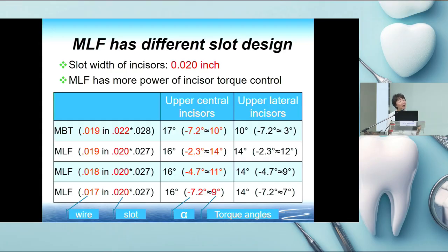That way we can retract the anterior teeth better, with better anterior torque control and less friction, so we get a better outcome.